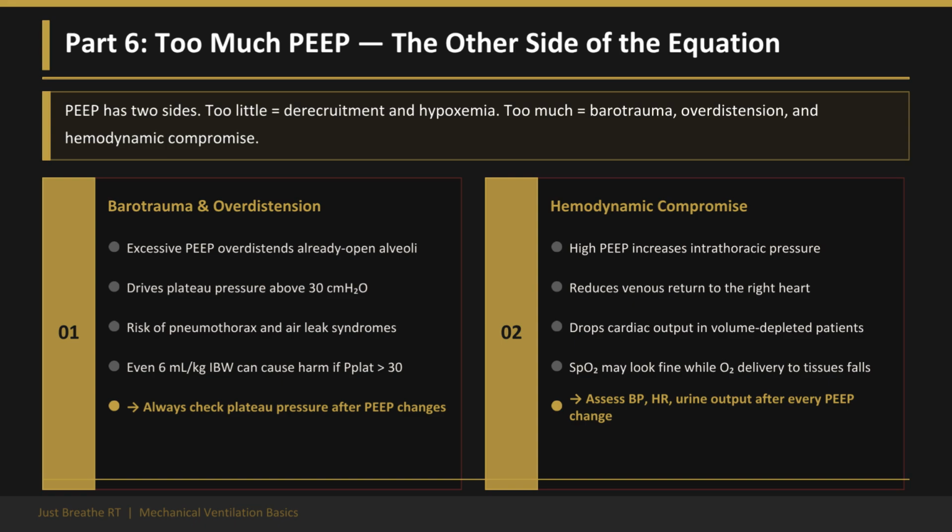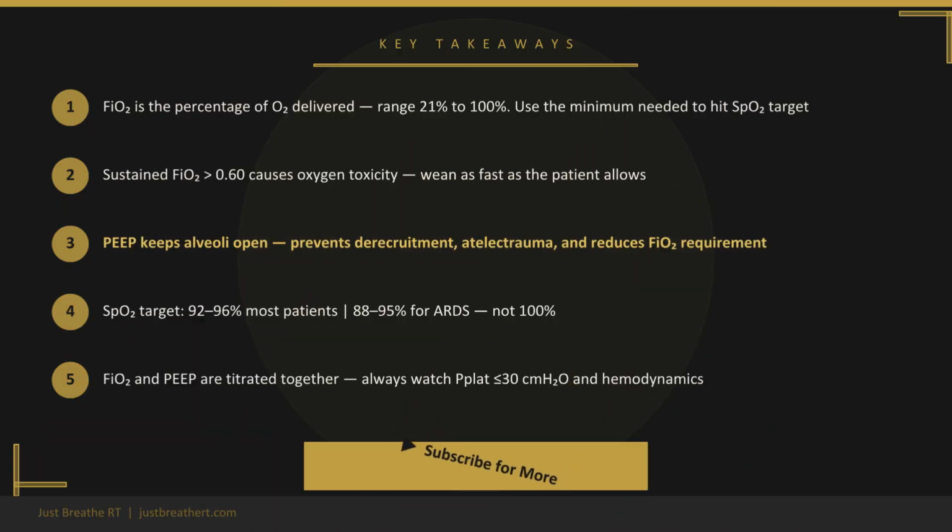The sweet spot is the PEEP that recruits the lung, maintains oxygenation at a safe FiO₂, keeps plateau pressure in range, and does not compromise cardiac output. Finding it is part science, part clinical judgment, and it develops with experience. Let's bring it all together.